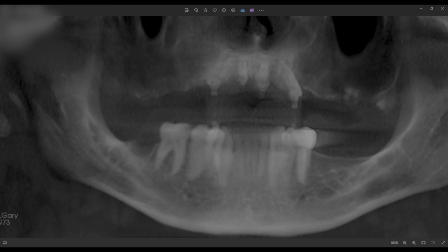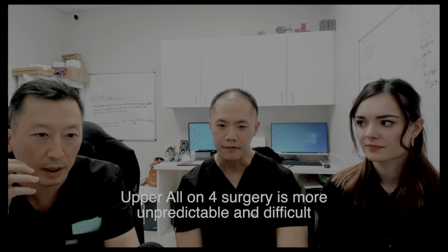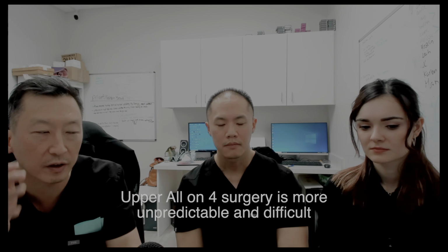So we explained this in other videos, and I would highly recommend the video we're going to link above that we did about a month or 2 months ago, talking about some all-on-4 basics. Anybody that does all-on-4 will agree that whenever you do all-on-4, it's always the upper one that's going to be way more unpredictable, right? So if you come in as a patient right off the street, you give us a call and say, hey, I want to do all-on-4, the complexity of an all-on-4 case is always going to be the upper jaw.